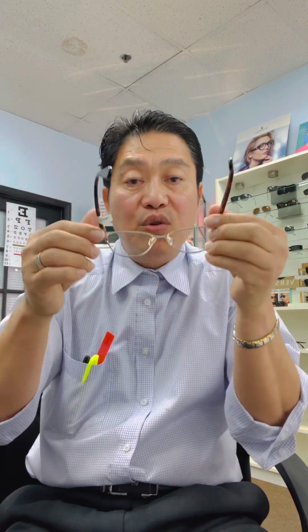And these two pieces here, we call these nose pads or nose pieces. This nose pad is the one that carries the eyeglasses on our nose bridge. It goes in here. Okay, the good thing with the nose pieces, it's very easy to adjust. If you want to lower your glasses, we can spread these nose pieces. If you want to raise up your frame, we can just squeeze this one and it goes up.